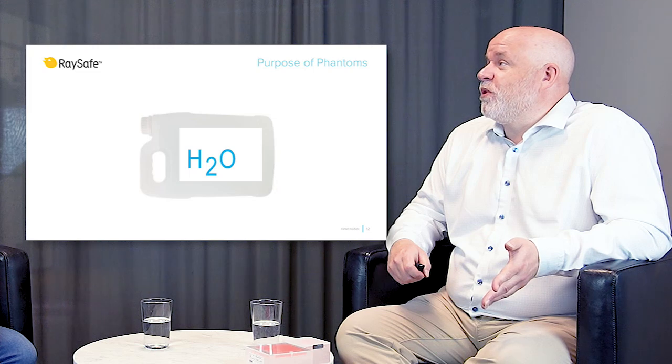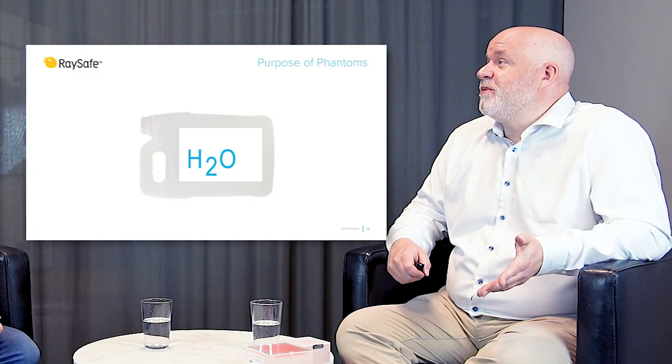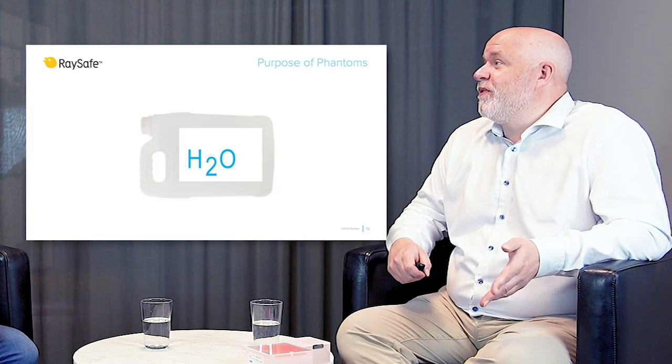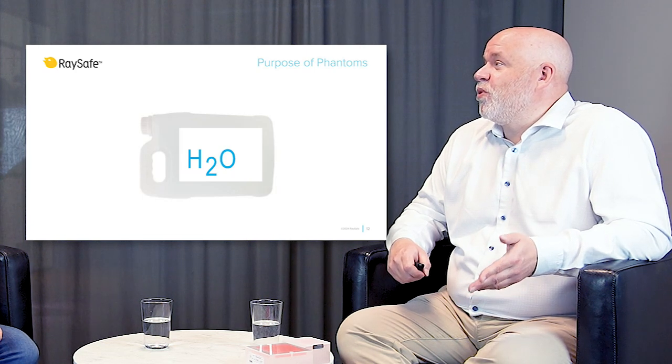Absolutely. And just looking at one of the simplest tools you can build is just a canister that's half filled with water and has a handle on the side. Think of it this way. The cap represents the head. The handle is like the left or right arm. The bottom of the canister stands for the legs. The water-filled part simulates the back, and the part with air represents the front.